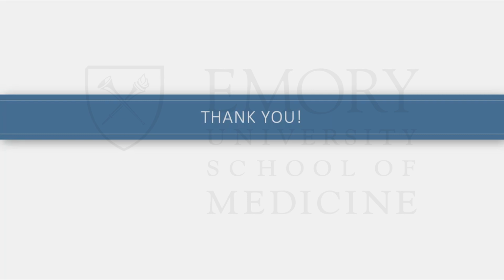Also, one of your slides, the second one, showed an L wave. You have to watch the sonographers because they'll measure that L wave in atrial fibrillation as an A wave, and you'll find the calculation up there for the E to A is really the E to L. I've seen that many times, so you can watch for that. A very good job. Thanks so much.